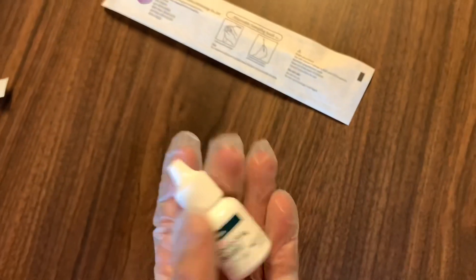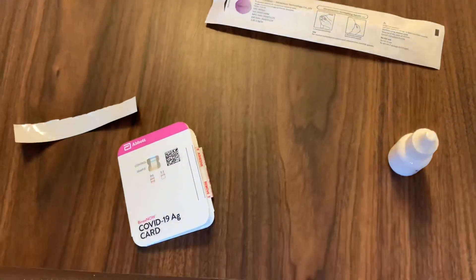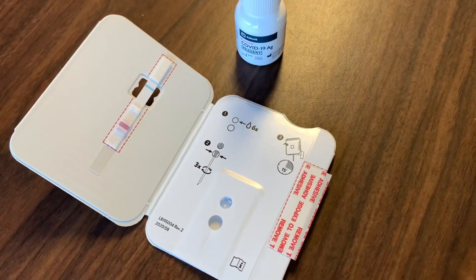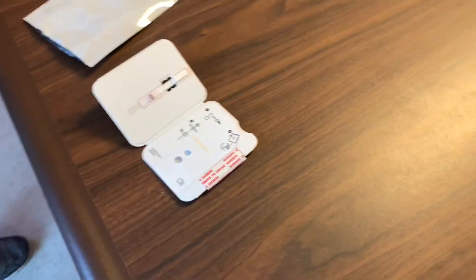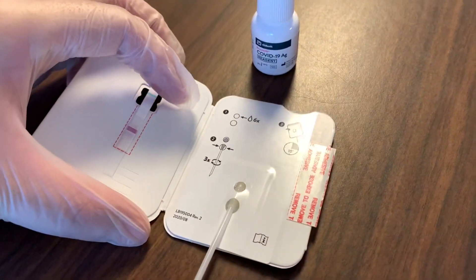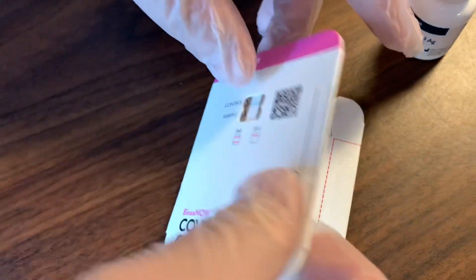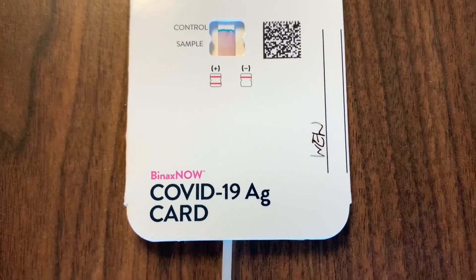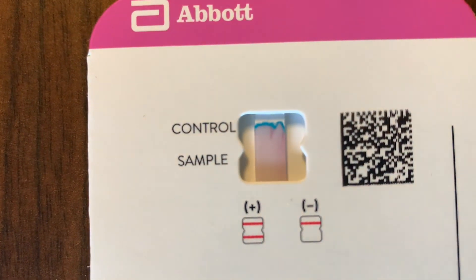And now let's practice. Open the card, six drops of the reagent, do your nasal swab, insert, squeeze three times, remove the adhesive, then close. Make sure you write your name, date, and time. Start the 15-minute timer and wait for your result.